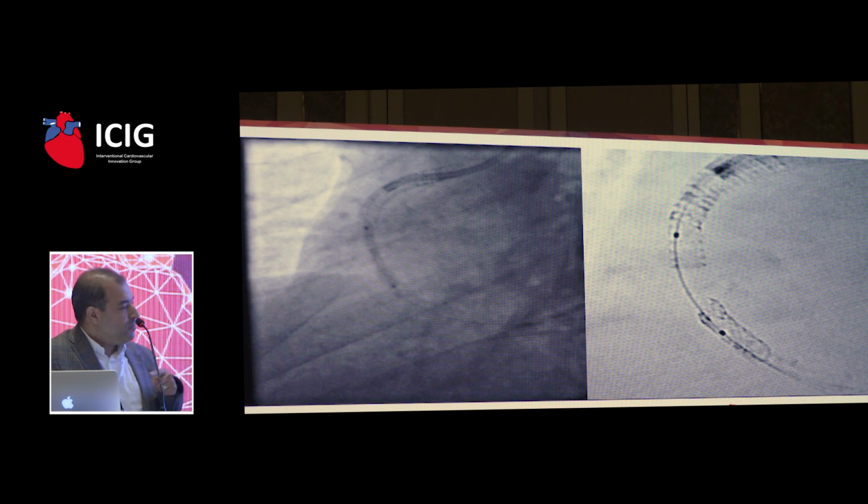Well, the geometry here in the stent boost clearly shows that the geometry is different. Yeah, but the distal end of it is very neat and clean. I'm talking about the proximal of a fractured one. The proximal of the distal? Exactly, the proximal of the distal. This is what I would expect to see up there too. This is what I'm telling you. So the geometry is definitely abnormal in the distal fractured one.